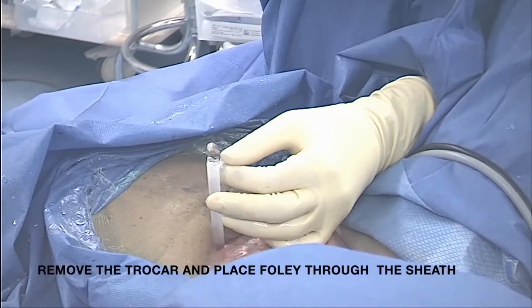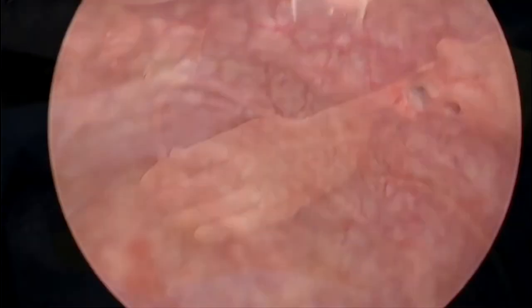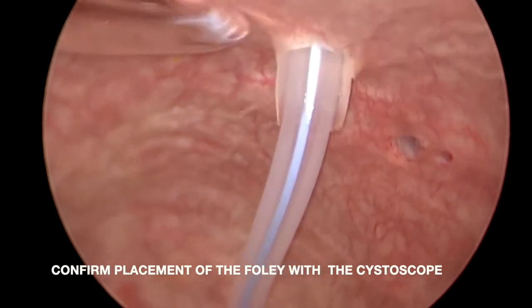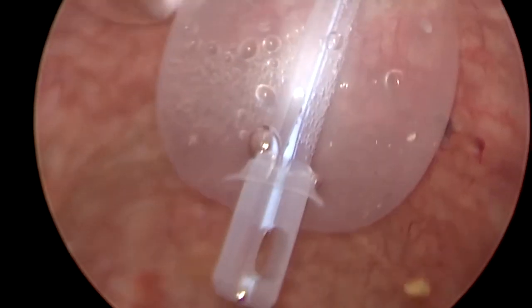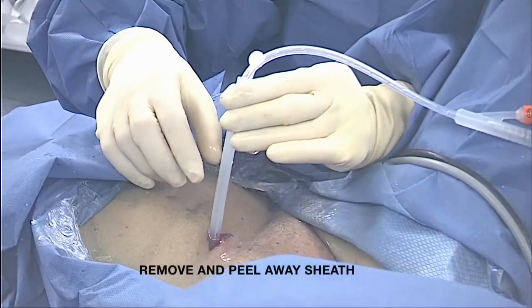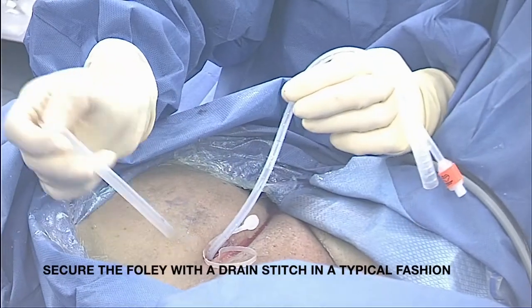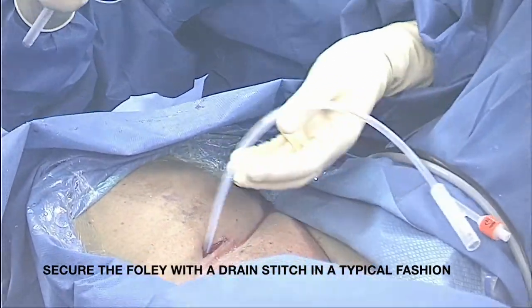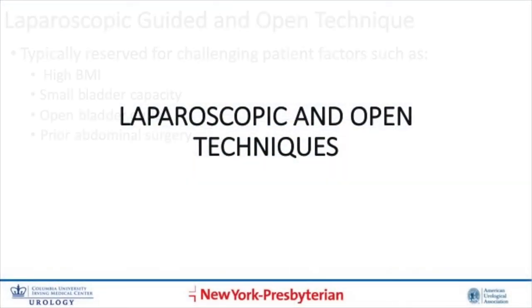Next, we remove the trocar and place the Foley catheter through the sheath, again taking care to confirm our placement with the cystoscope. Next, we can inflate the balloon to secure the catheter in place. Now, we remove and peel away the sheath. Lastly, we can secure the catheter with a drain stitch in the typical fashion. This concludes the trocar technique.